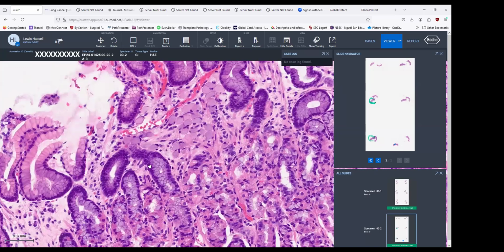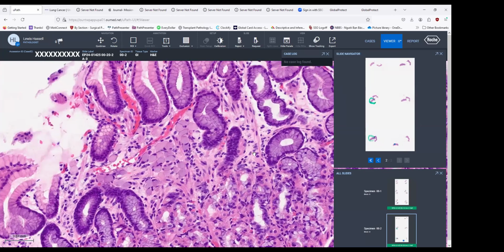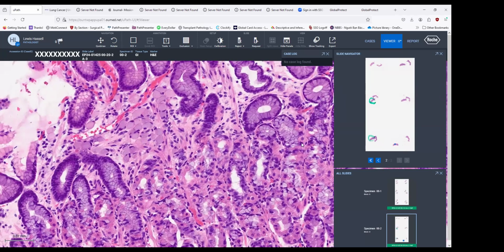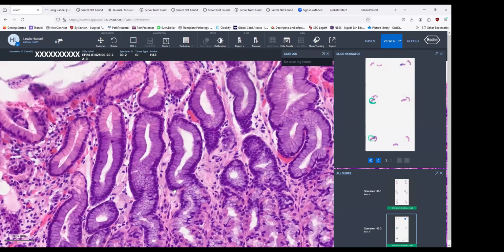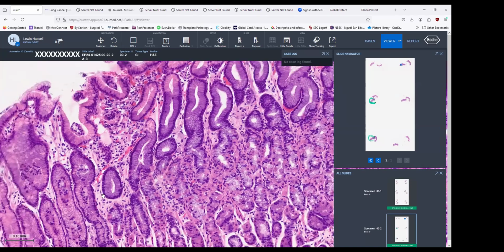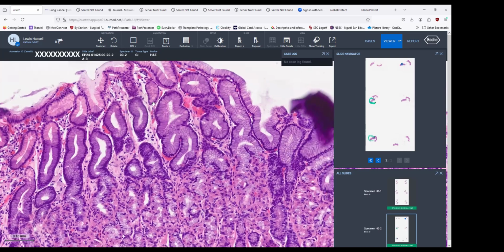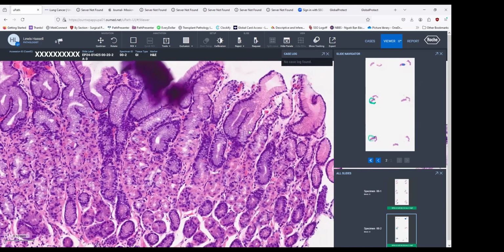And so we see those primarily in neoplasia. We look around to see, are there other features of dysplasia? Are there other areas? We went back to the first level here, and as we look around, you'll see that we don't see them. So this, I think, underscores two important principles. One is doing sequential levels can be helpful in uncovering unexpected findings.